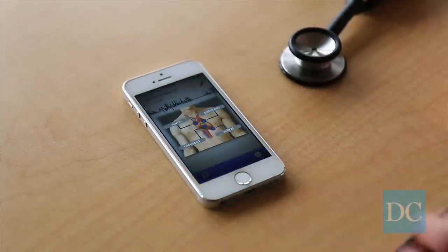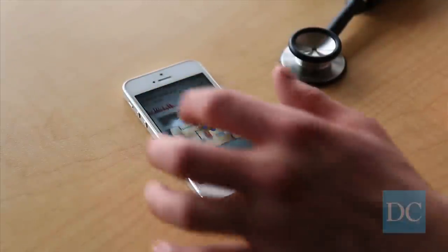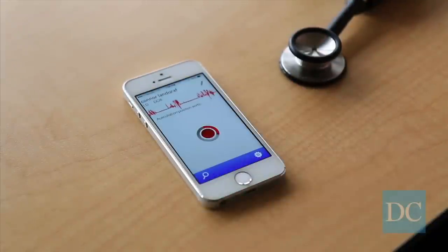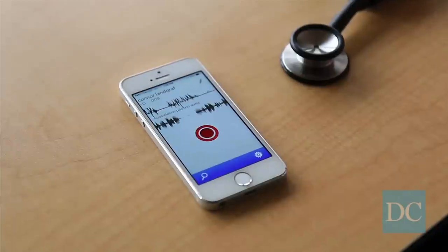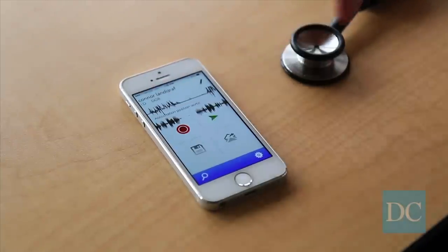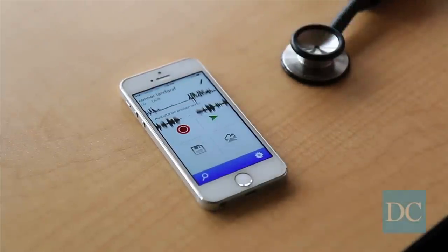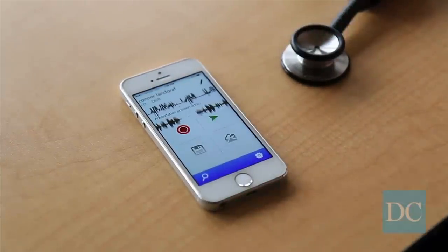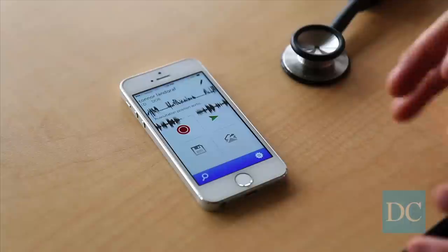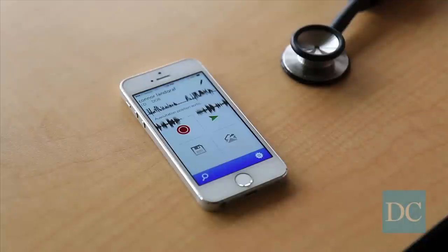I can record it, choose a location, record that patient's heart sound, look at it and see a waveform, look for murmurs, and share it with other physicians. I get all of the analytics of a digital stethoscope with an analog stethoscope.